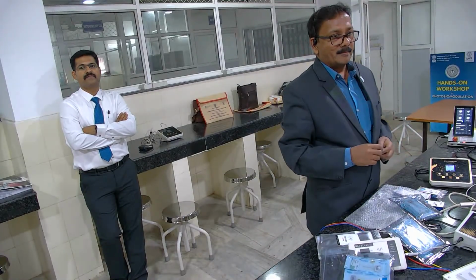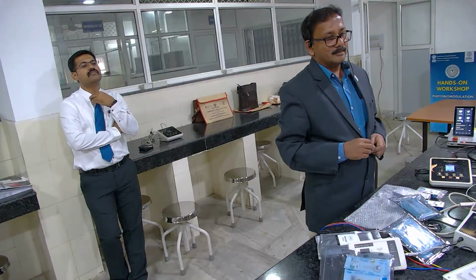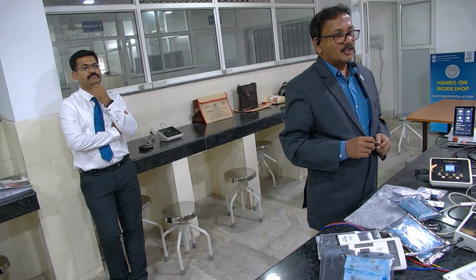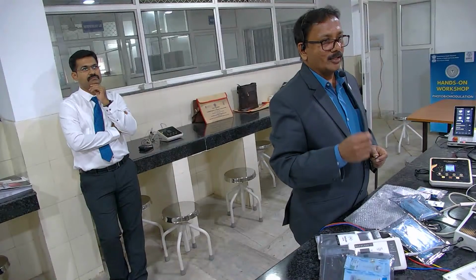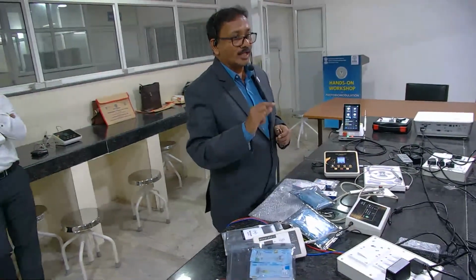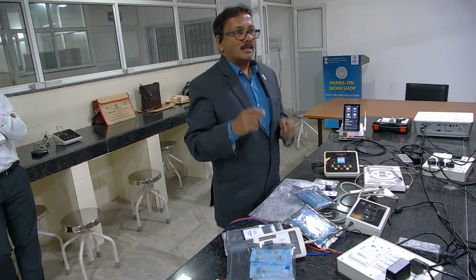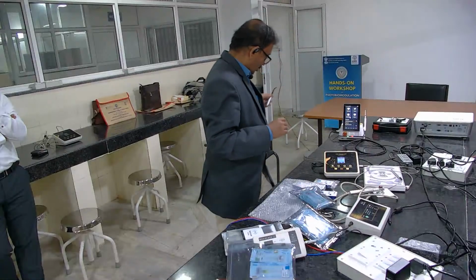Yes, take the mic. Is there a time boundation till when the laser will stay at particular tissues? Means for 5 minutes, 10 minutes? We have given it for 1 minute. We speak in the language of how many joules have to be delivered for a definite condition, either 6 joules, 8 joules, or 12 joules. Depending on that, we make the calculations, which I will be explaining in detail tomorrow morning. How to calculate the dosimetry is very, very important. Right? Any other questions? Okay, let's move to the next part of the laser.